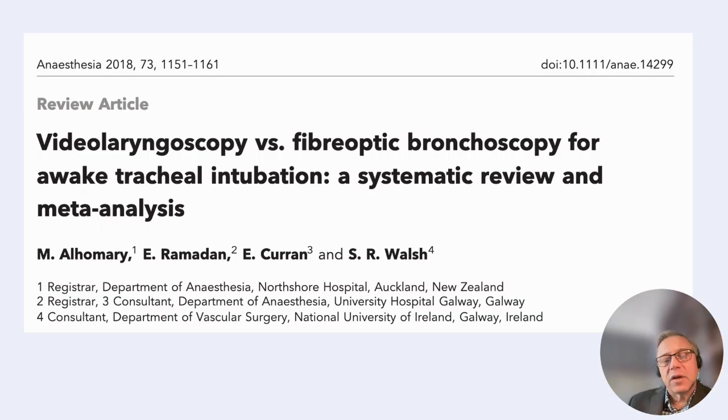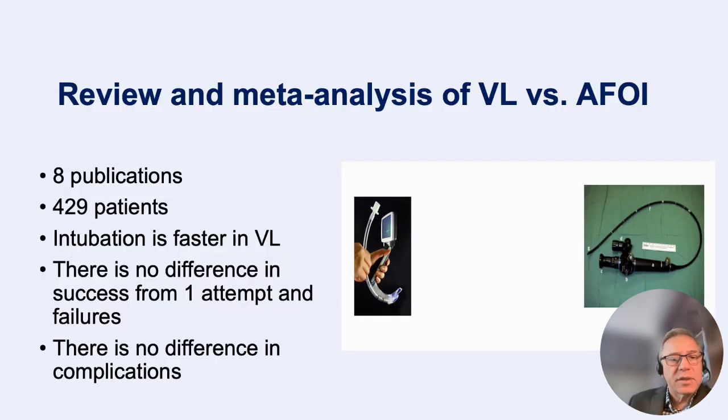And this is the article as far back as 2018, comparing video laryngoscopy and fibre optic bronchoscopy for awake tracheal intubation, a systematic review and meta-analysis. They looked at 8 publications, and they found that intubation is faster in video laryngoscopy. There was no difference in success from first attempt and no difference in complications.